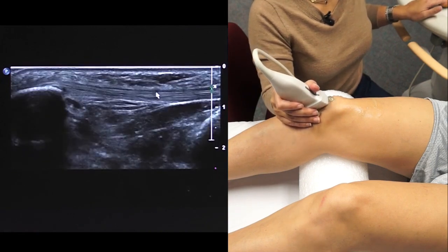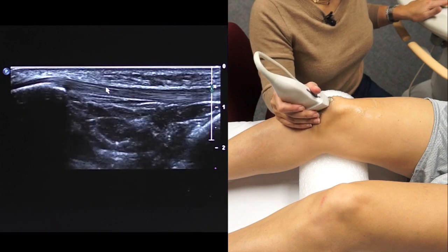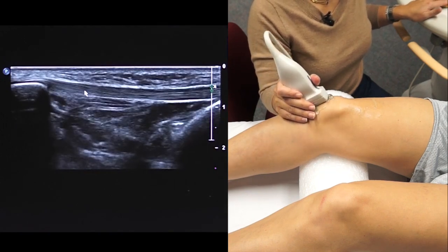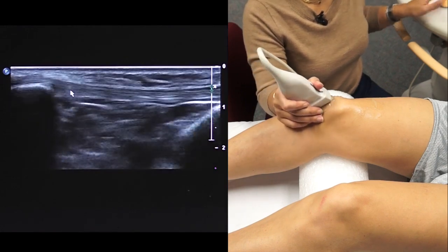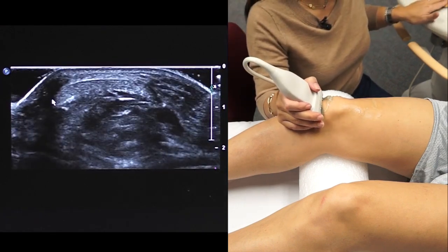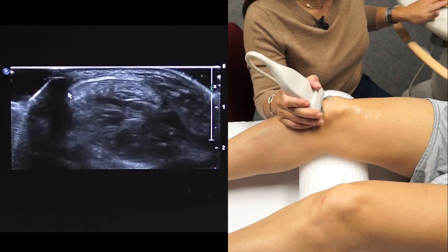Now the patellar tendon is a wide structure, so when you're scanning it, you should sweep from medial to lateral. As you can see, as I'm sweeping, we see tendon throughout. And you also want to image this in the transverse plane. And here you can appreciate that it is a flat and wide band.